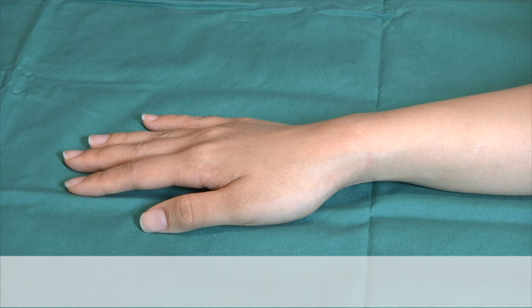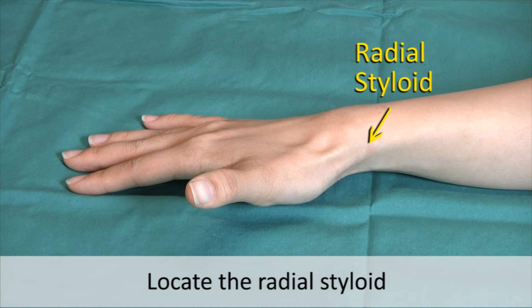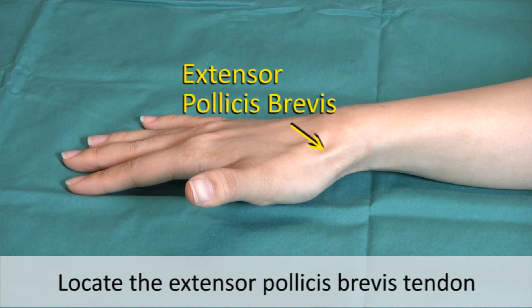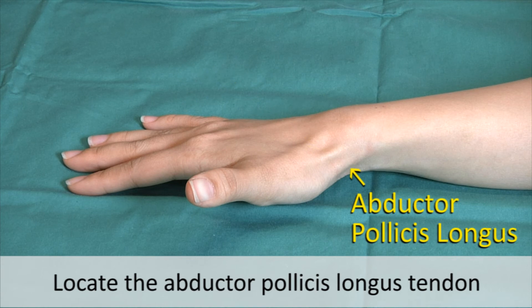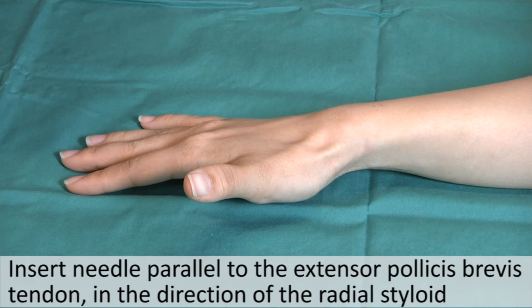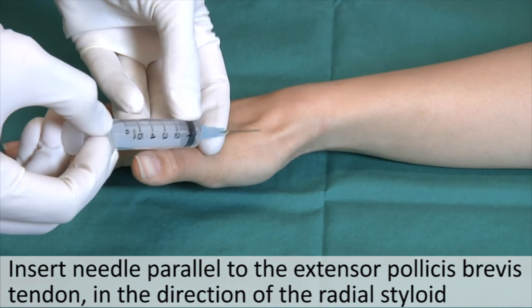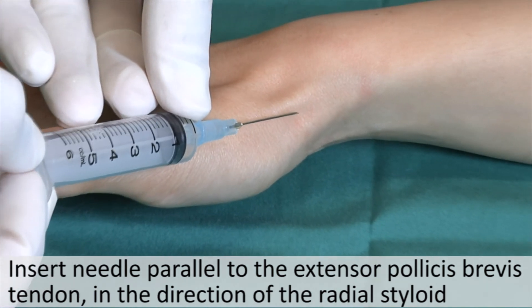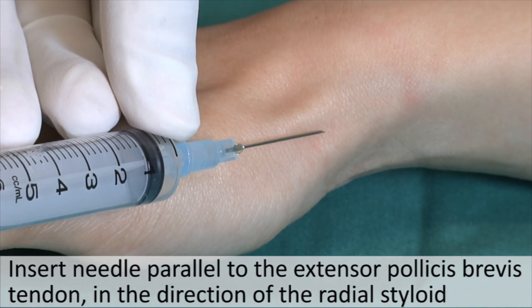Next, locate the radial styloid. Locate the extensor pollicis brevis tendon and abductor pollicis longus tendon. Insert the needle parallel to the extensor pollicis brevis tendon in the direction of the radial styloid.